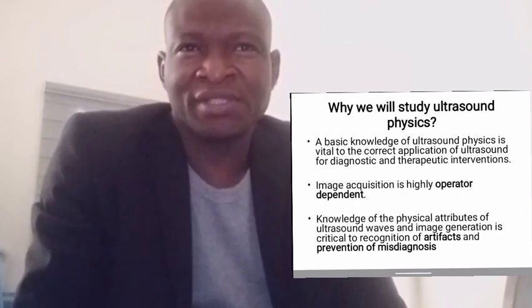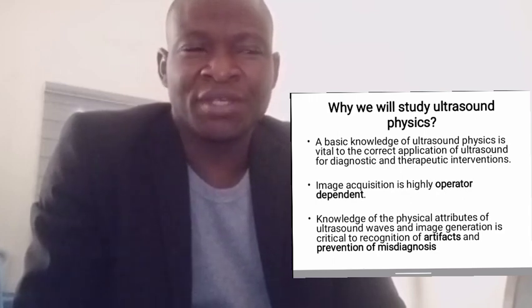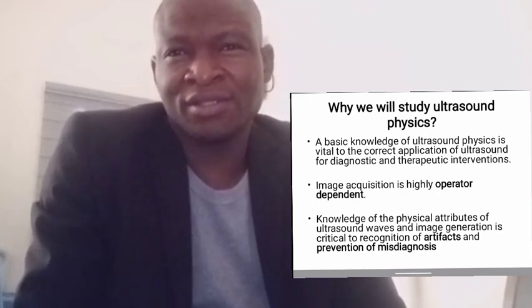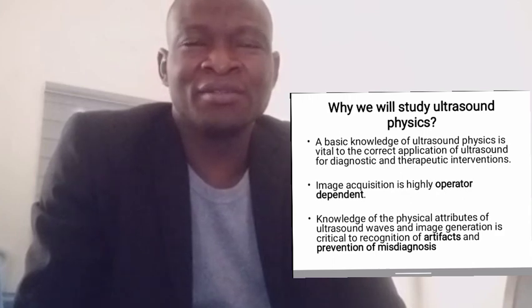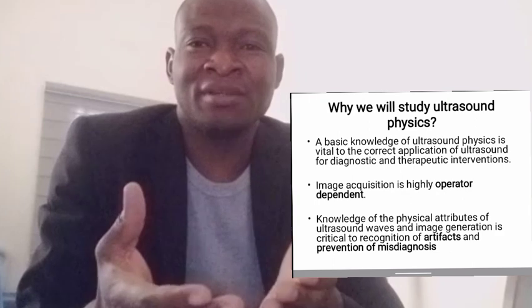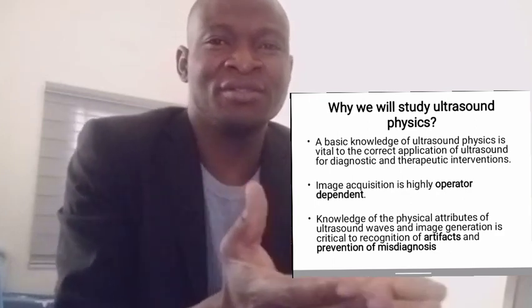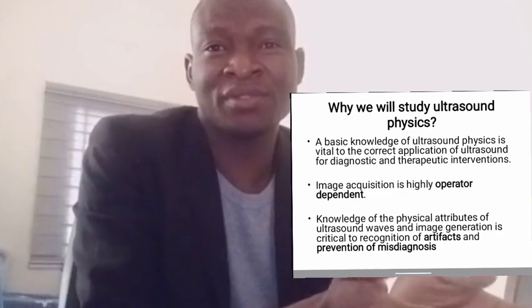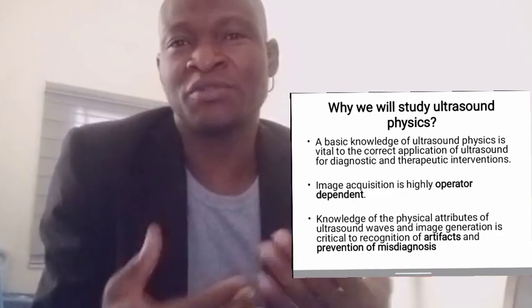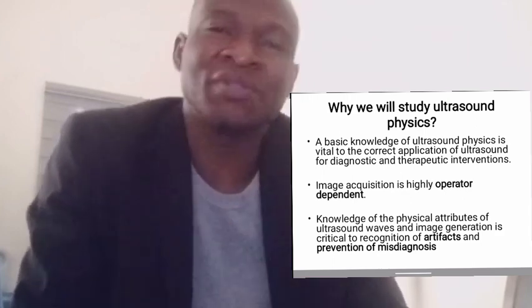Image acquisition is highly operator dependent. So the device really produces for you the images that you make it produce.